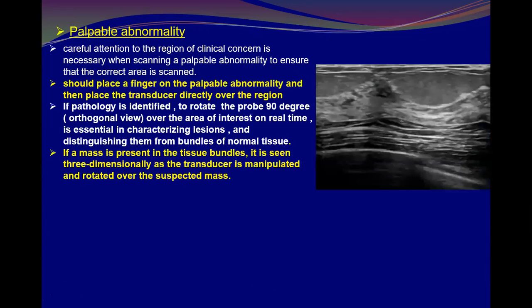This is my case with a patient having a palpable abnormality. We have to put our finger on the exact area of the palpable abnormality before scanning the area, and while scanning, make sure the transducer is exactly over that area. When we scan, we can see this is just an area of a fibrous ridge.